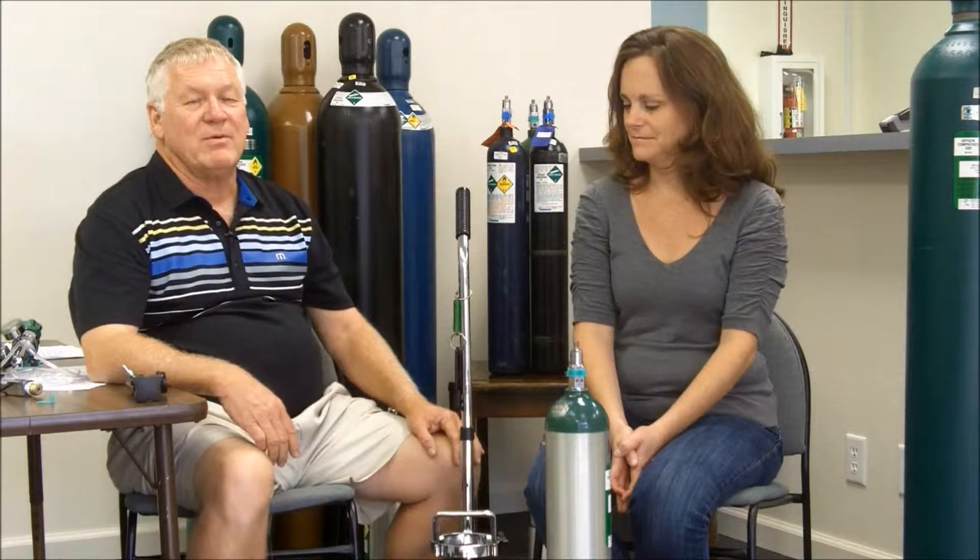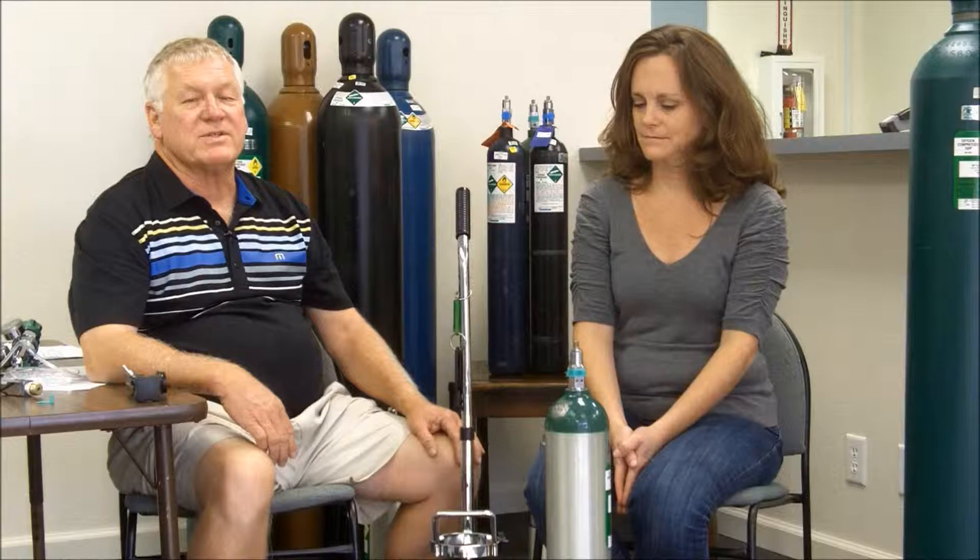Hello, I'm Richard Murray. I'm the owner of M4 Oxygen Service. I'm also a registered nurse and a registered respiratory therapist. I'm frequently asked to give in-services to medical staff on the proper and safe use of oxygen. So today I'm going to instruct Kelly on how to put a regulator on a cylinder for patient use.